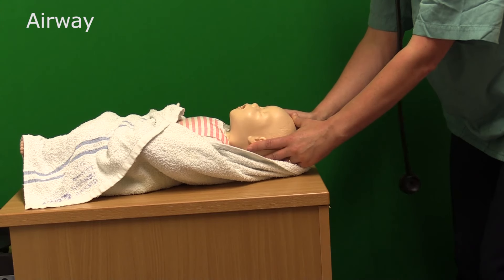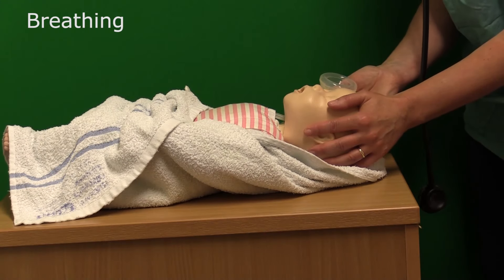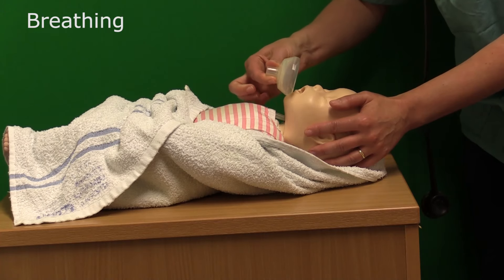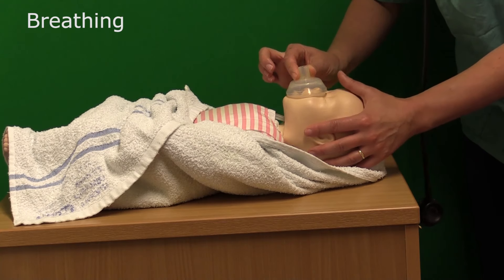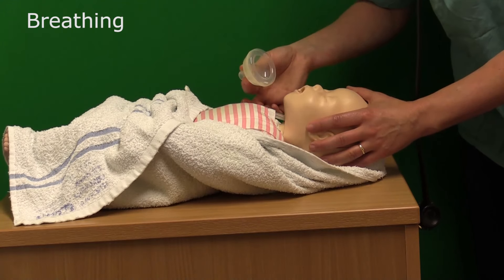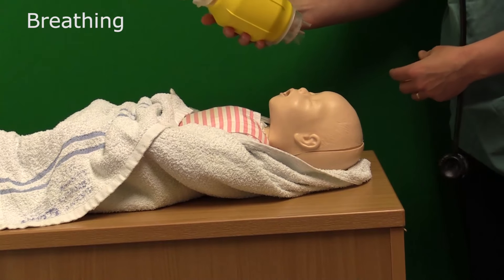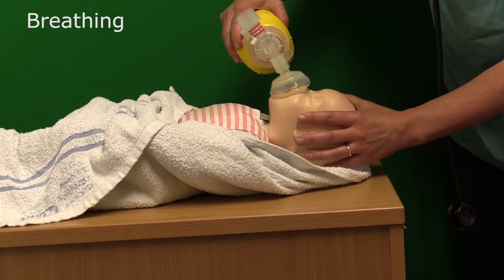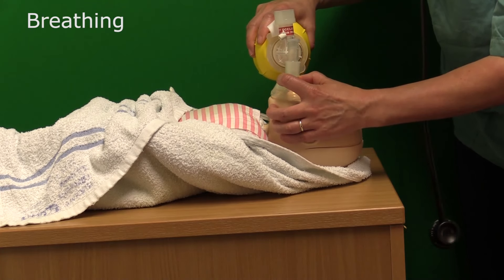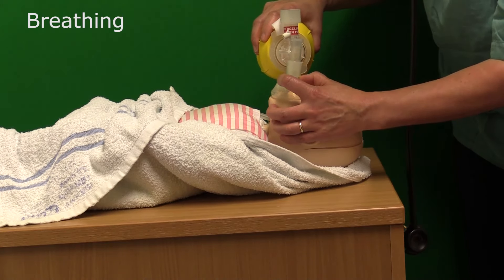If this makes no difference, then we need to give the baby five inflation breaths. In order to give the baby inflation breaths, we need to find an appropriately sized mask. The mask should be a perfect size that fits in the baby's cleft of the chin and is rolled over the baby's nose and mouth, fitting as tightly as possible — it shouldn't go into the baby's eye socket area. Once you've sized the mask up, you attach it to the device you're going to use — in this instance, a bag valve mask. You roll it back over the baby's nose and mouth, using a C and E grip to hold the mask in place and prevent air escaping, and give five long sustained inflation breaths.